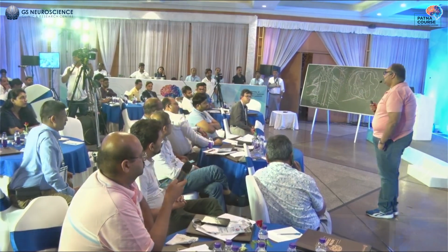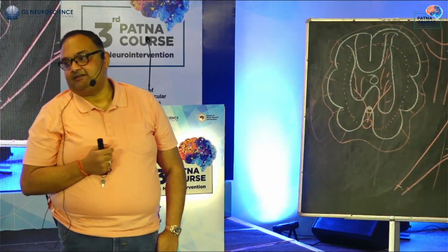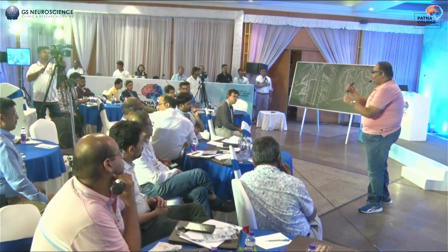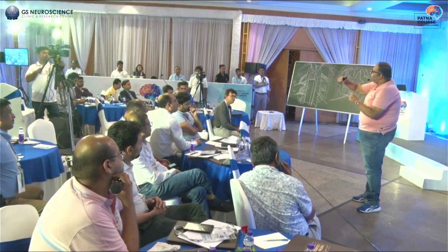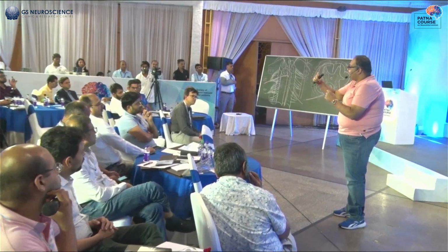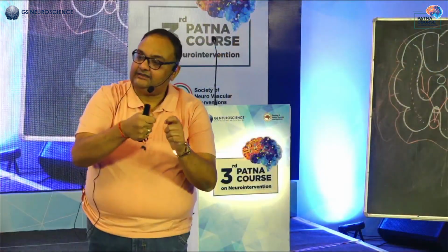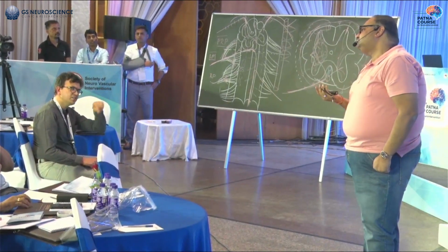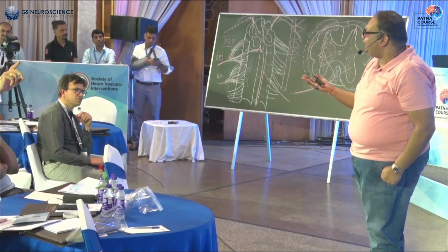No. Cobra is a good catheter for diagnostics, but it's a big, bulky catheter. And it will always keep on pointing down. And it's very stiff. So the moment you try to wedge it, it will come out. So you can do this with the Cobra and then over the wire exchange with Yeah, why do you want to exchange? I mean, you can hook it again.